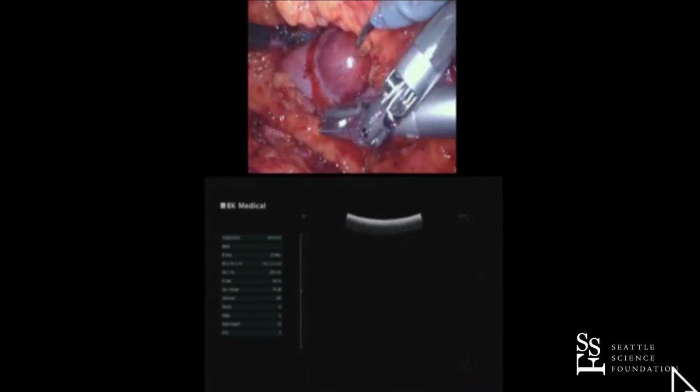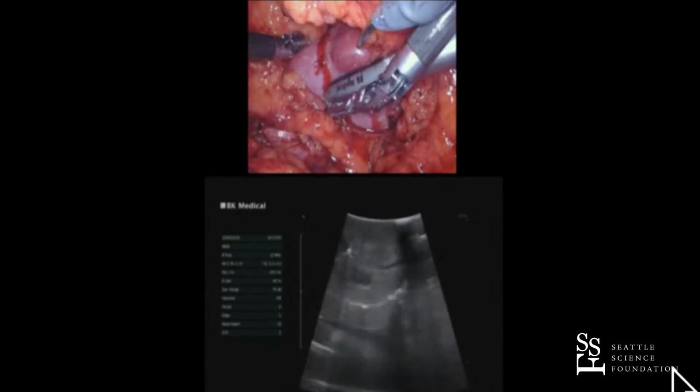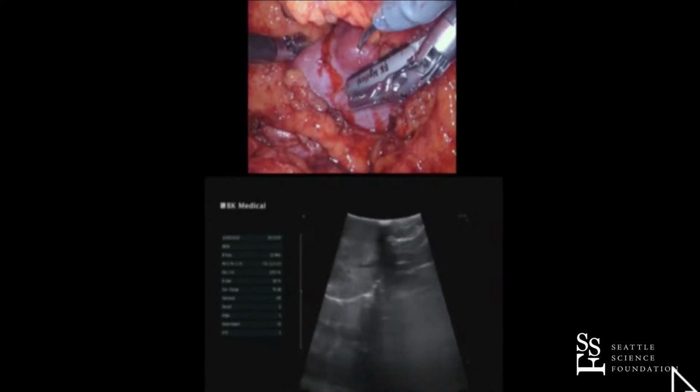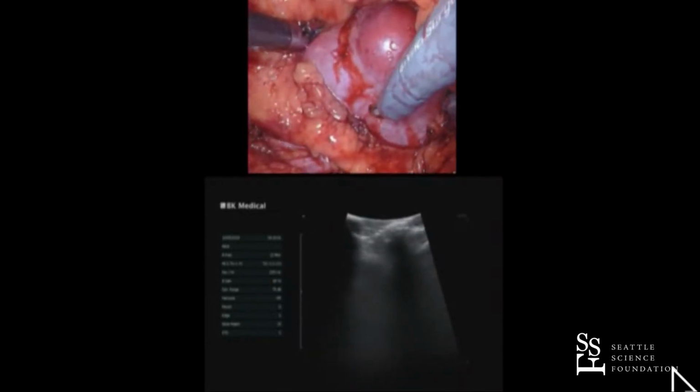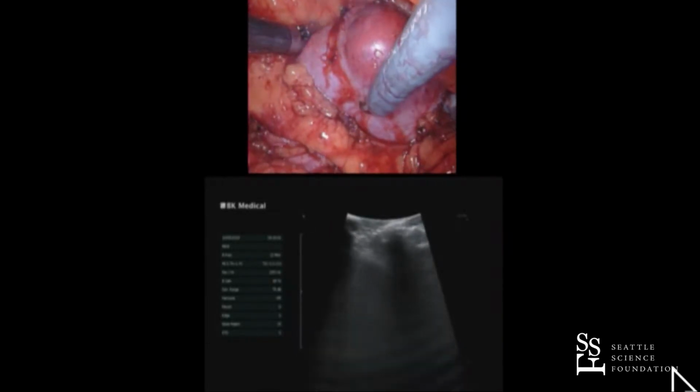You don't have to be right on the tumor. Some people would even try to enucleate this tumor. I wouldn't do that. I want to get a negative margin, like a visibly, grossly negative margin. So I don't really try to gild the lily and get these tiny margins.